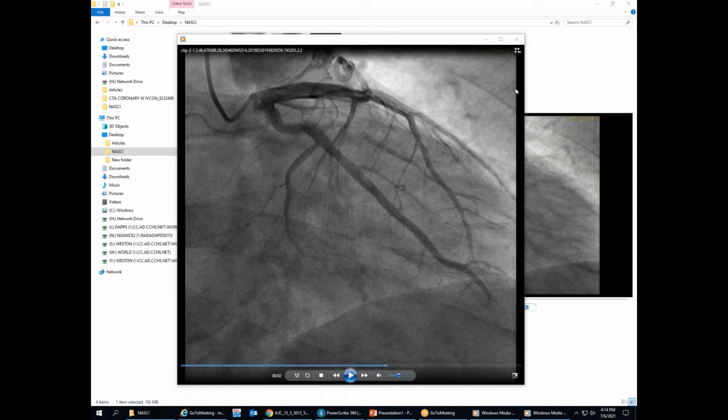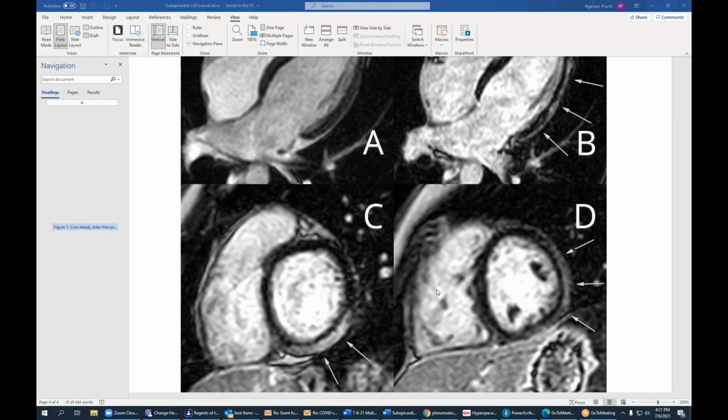And you see that the higher percentage of patients with dilated left ventricle presenting with, let's call it a pseudo non-compaction, just because of the stretching? I don't know if I would say that. I've never kept track of it. I just know that when we've seen it and we question it, it's very close to call, and the patient has a dilated ventricle anyway. It's probably just part of that. But I couldn't say that I see it all the time or half the time. I really don't know.